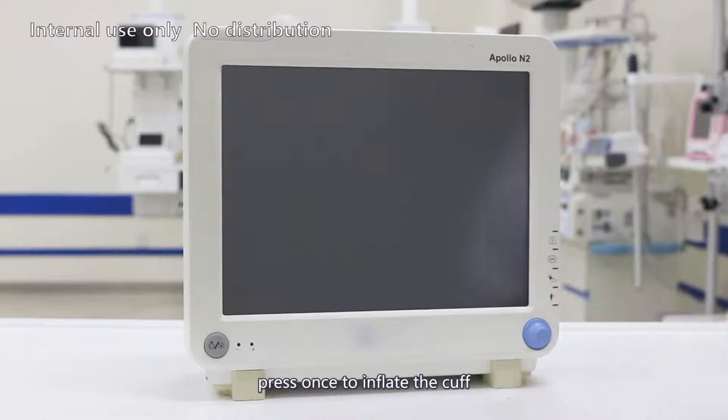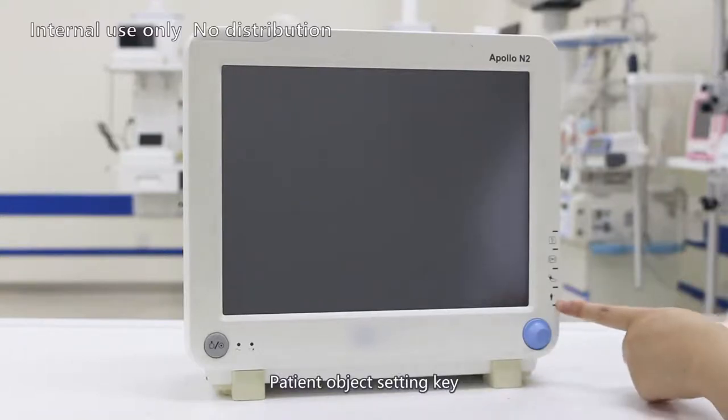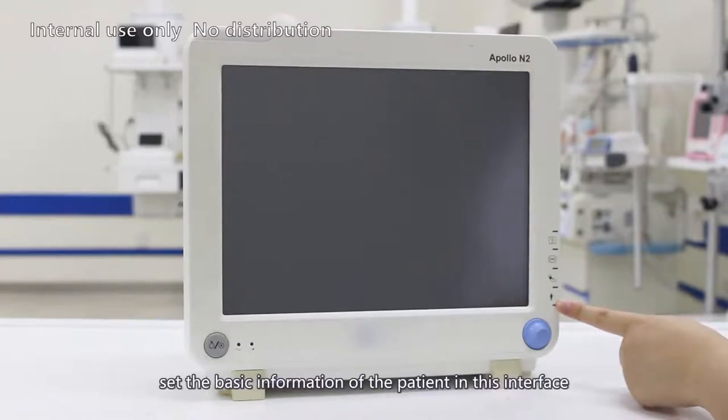Blood pressure measurement key. Press once to inflate the cuff and measure blood pressure once. Patient object setting key. Set the basic information of the patient in this interface.